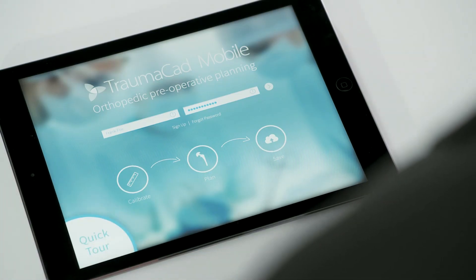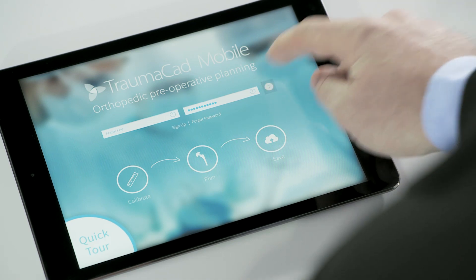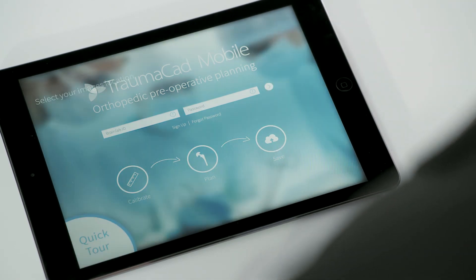To begin, download the TromaCAD Mobile application from the App Store and log in using your BrainLab ID and password.